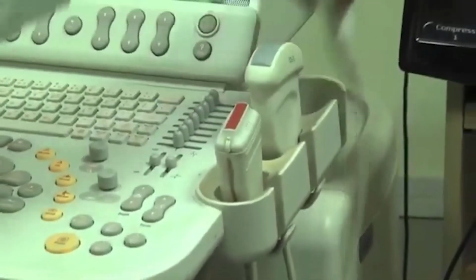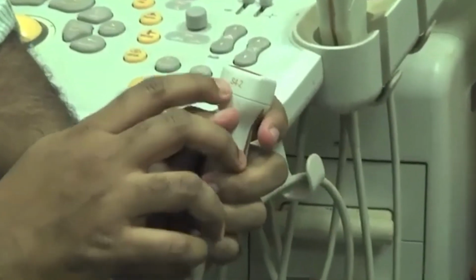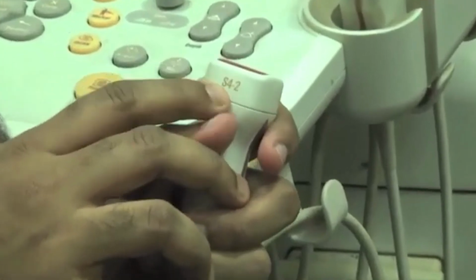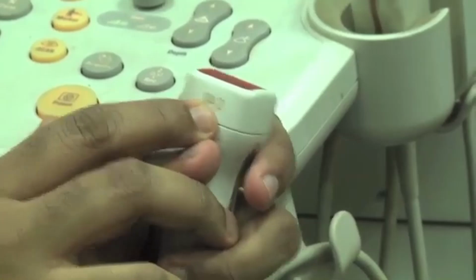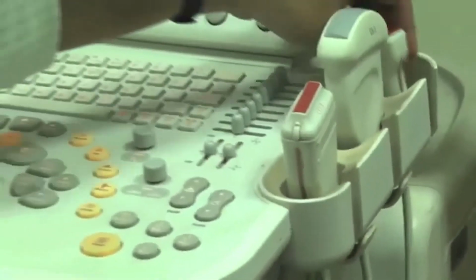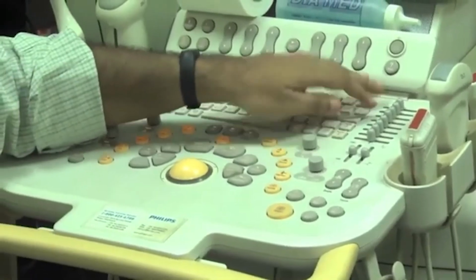Now the other probe which we had seen was a sectoral probe for cardiac imaging. So this was an S42, and this is sectoral at 4 megahertz, the second generation of that particular probe over here. Now some other controls which you can see up on this particular control panel over here.